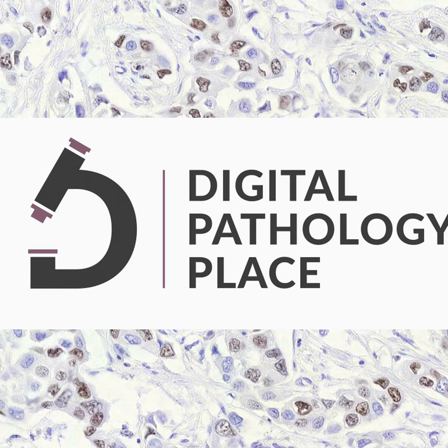So these are the designs. Hamamatsu now has this new device called Moxiplex. It's a fluorescent scanner for a lot of markers. I think in this one we have 9 markers. So the Hamamatsu team wanted to highlight this one where we have all the 9 colors. I also love this brain section because it's just so cool, and I like this design.